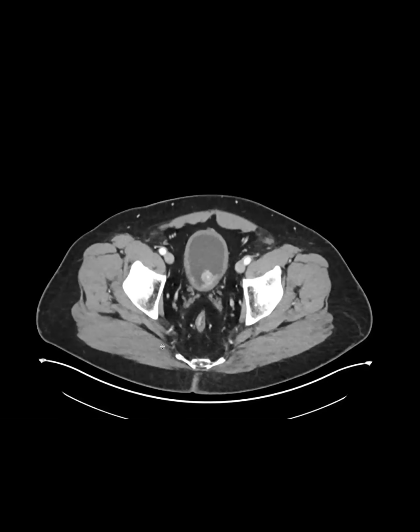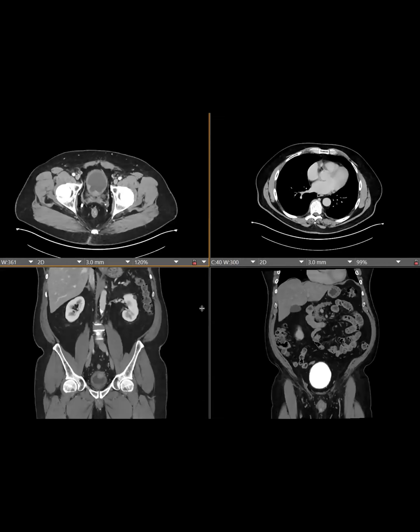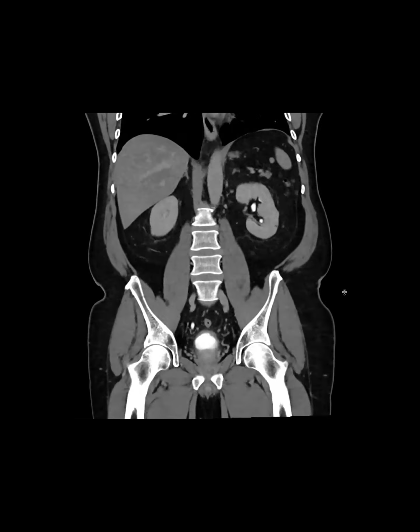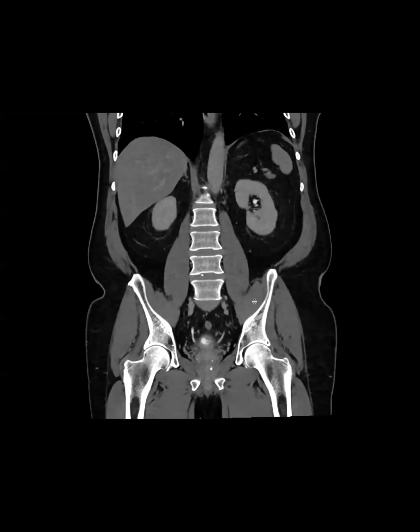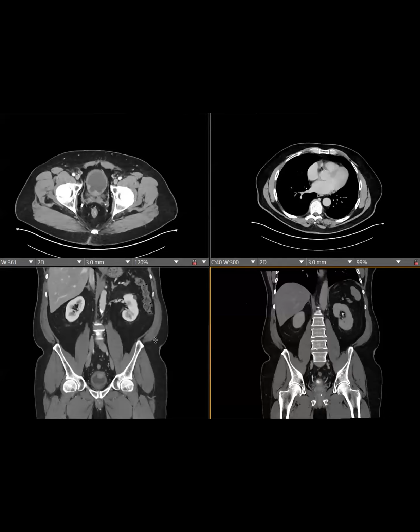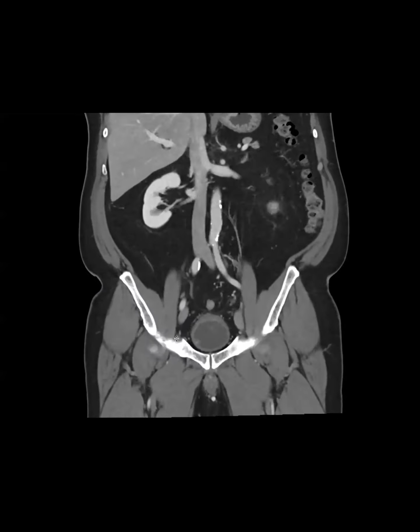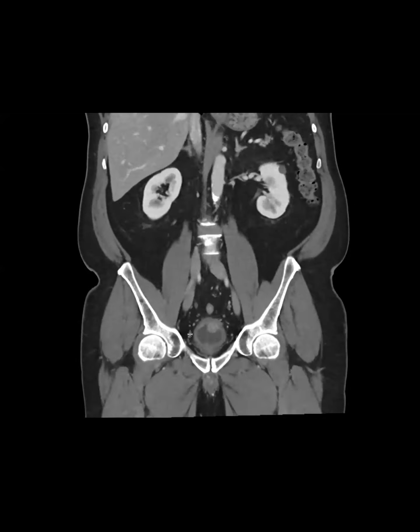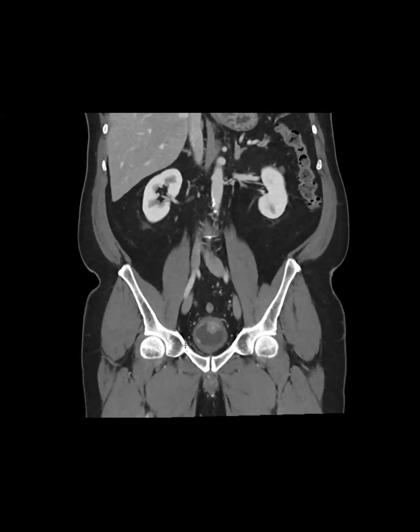But for the bladder, oh, you mean like looking at the papillae? Papillary necrosis is actually a reasonably common cause of hematuria, and it's under reported, underappreciated, and reasonably common. Yeah, I think we need the urographic phase. I don't know if venous is better, but I think venous is extremely complementary and needs to be part of the protocol. For example, we have a split bolus protocol that I don't like.